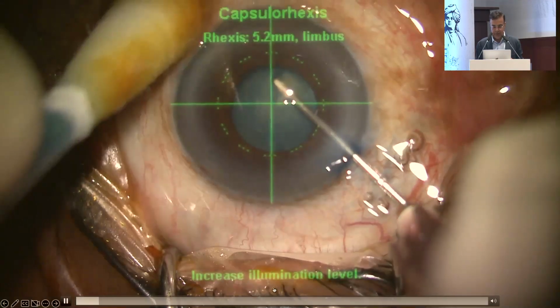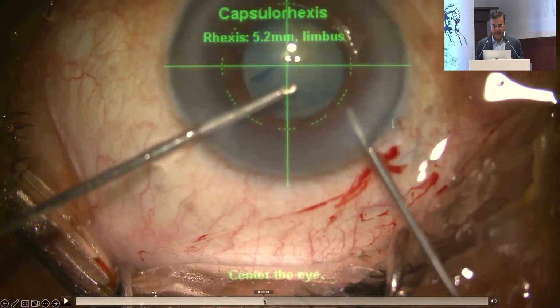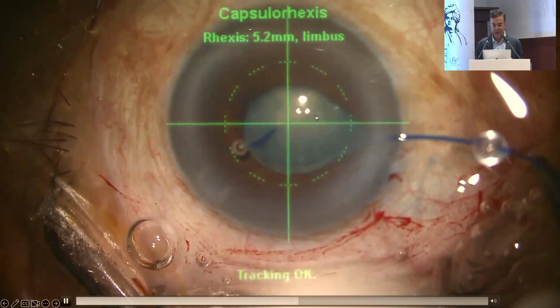Now again, he's already shown you a few things. I'll just show you. In this patient, I had a rhexis where I was somehow getting a small pupil and I was managing it. And here it started running out over here, and I had no space. I was trying to use the micro rhexis forceps, but it wasn't allowing me.